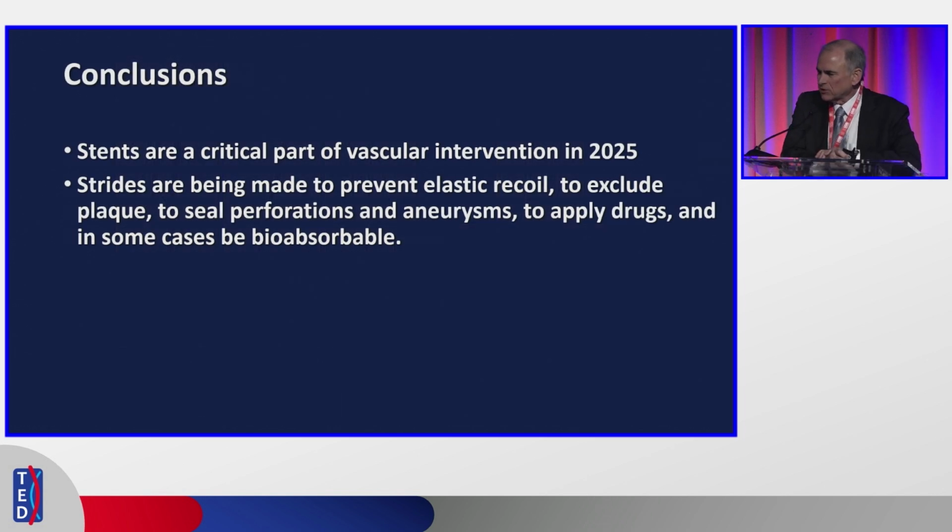Stents are a critical part of vascular interventional medicine, and strides are being made to prevent elastic recoil, to exclude plaque, to seal perforations and aneurysms, to apply drugs, and in some cases, be bioabsorbable. But you know, and this was all for SFA, by the way. That's why I didn't have anything about the bioabsorbables.